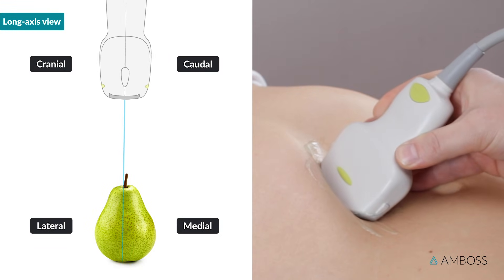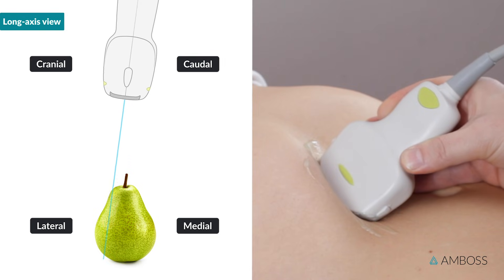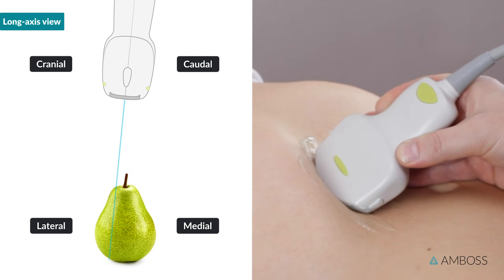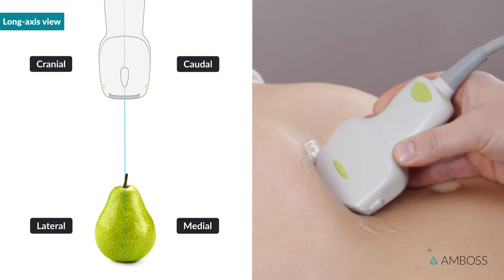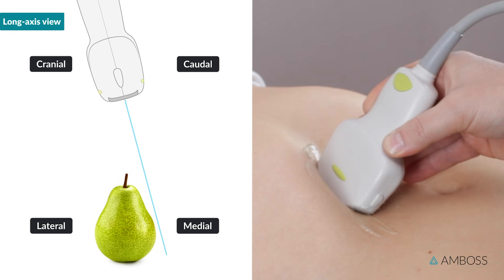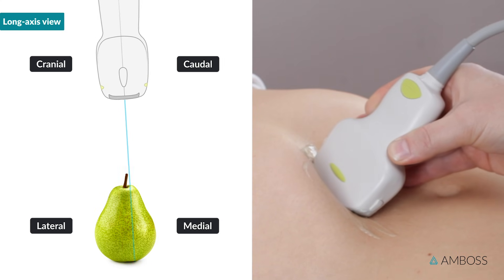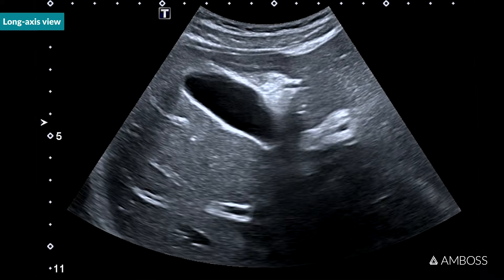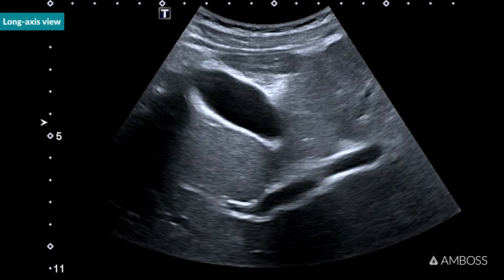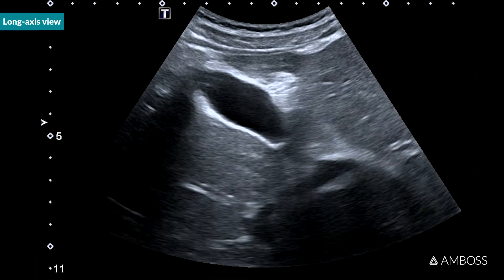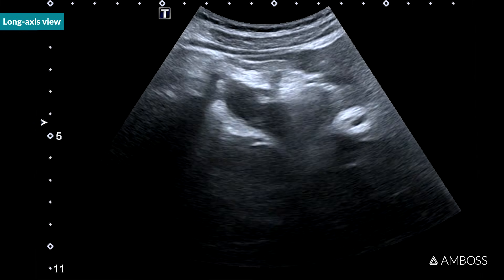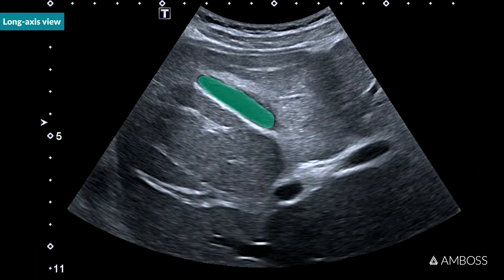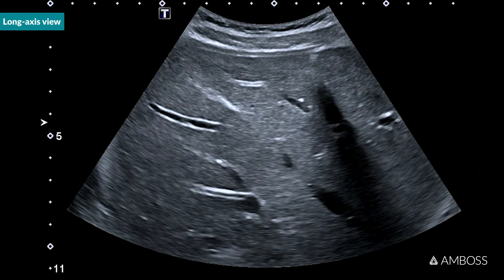So with the probe oriented as shown here, tilting the probe caudally fans through the lateral parts of the gallbladder, and tilting the probe cranially fans through the medial parts. To be able to confidently rule out wall abnormalities, you need to fan all the way through the gallbladder, until the anechoic lumen disappears completely.